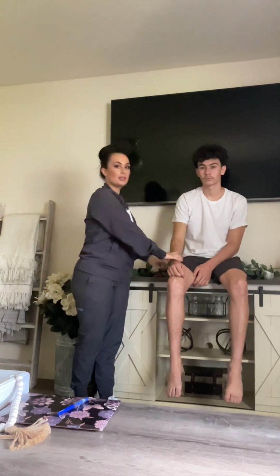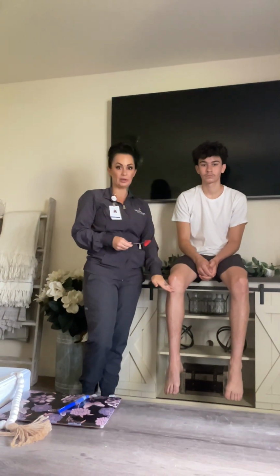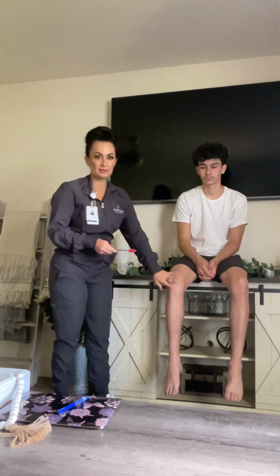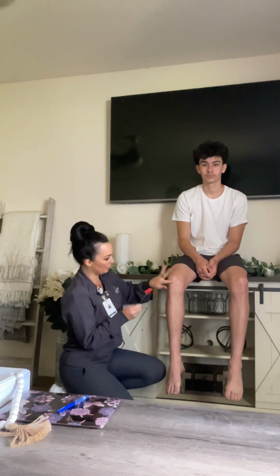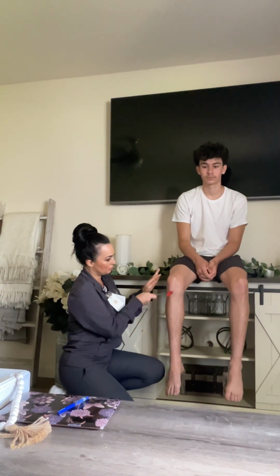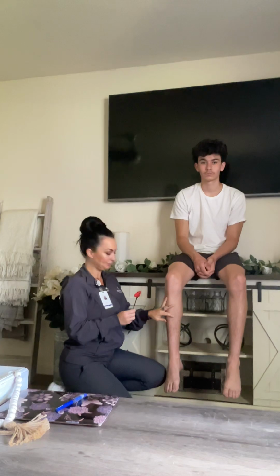Go ahead and relax. I'm now going to go down to the patellar tendon, which is just below the kneecap here. My patient should be relaxed, which he is, and dangling. I'm going to find the spot just below the kneecap, and I'm going to use the flat end this time to tap. A normal response is when the lower leg kicks forward slightly, which we did see here.